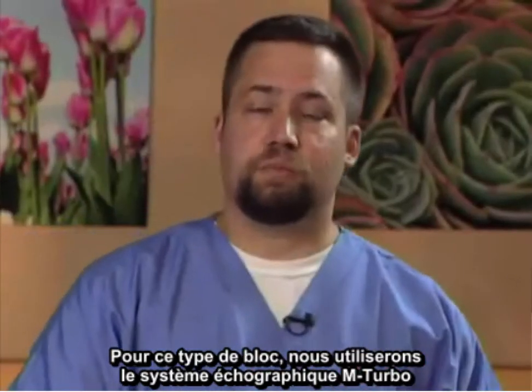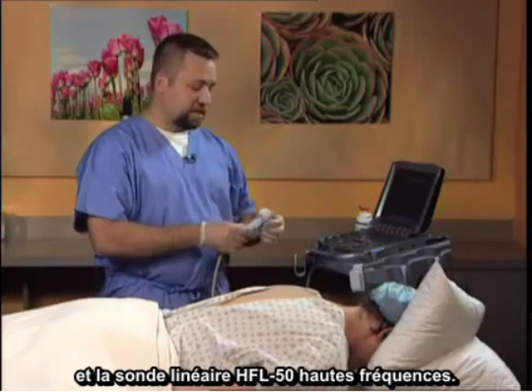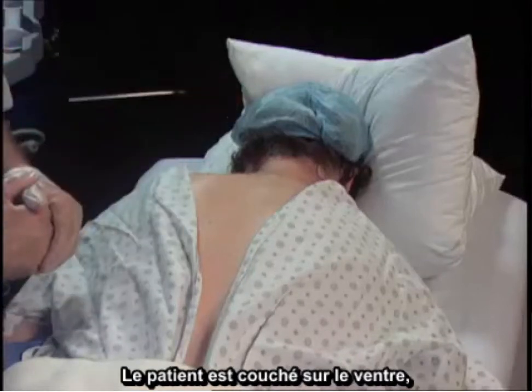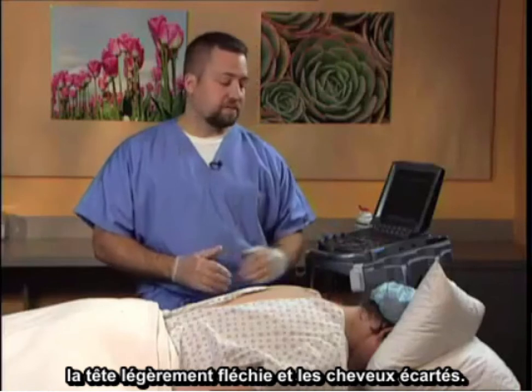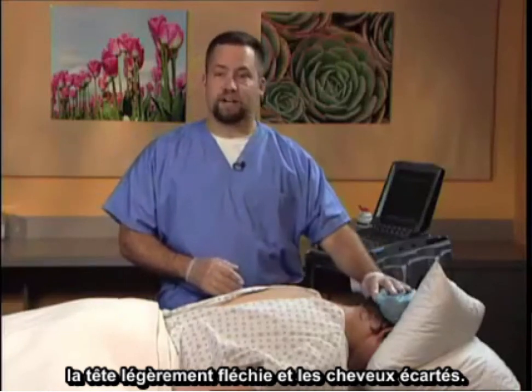Utilized in this particular block will be the mTurbo ultrasound system, utilizing the high-frequency HFL50 linear probe. The patient is placed in the prone position, a bolster is placed under the thorax, the head is slightly flexed and then the hair moved out of the way.